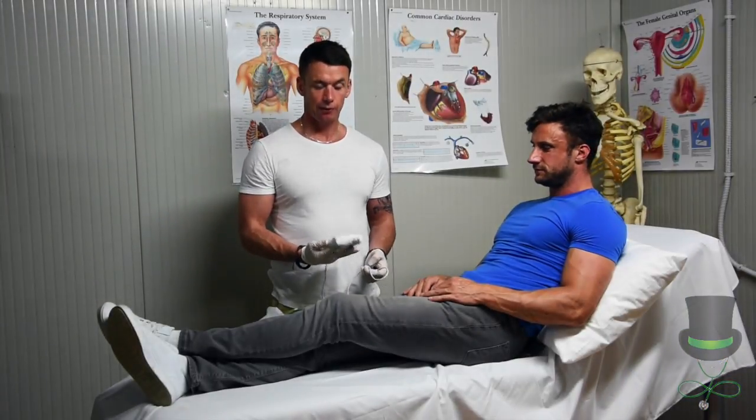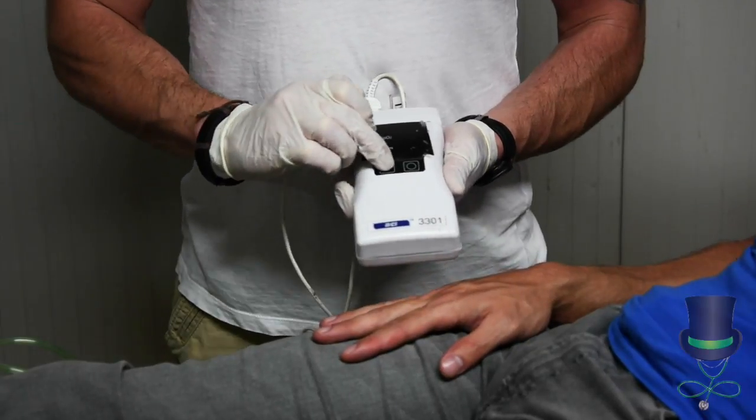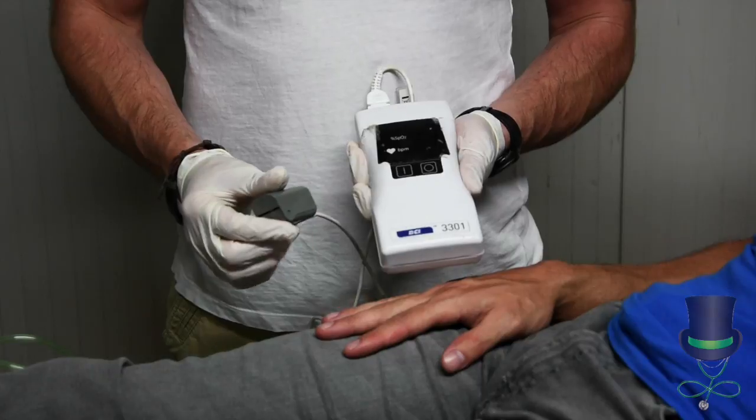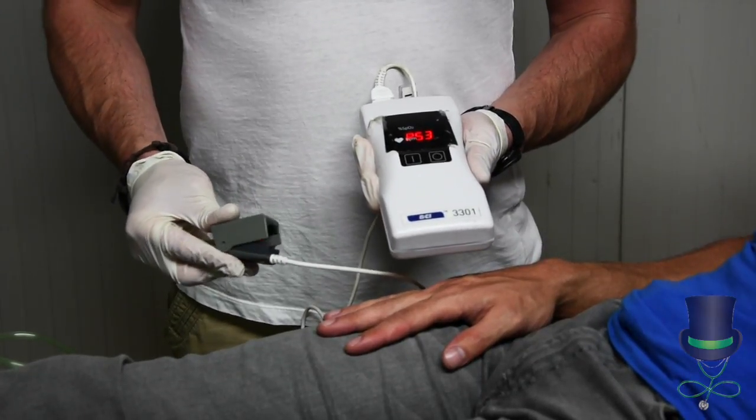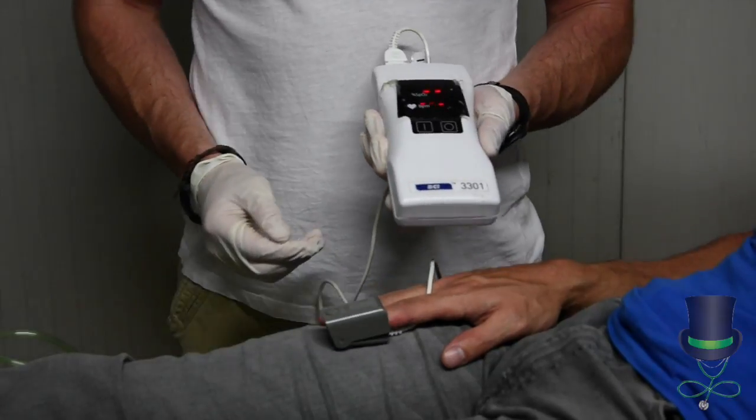Hi, I'm Anthony and I'm going to demonstrate the use of a pulse oximeter. Turn on the pulse oximeter and place the sensor probe onto the index finger like so.